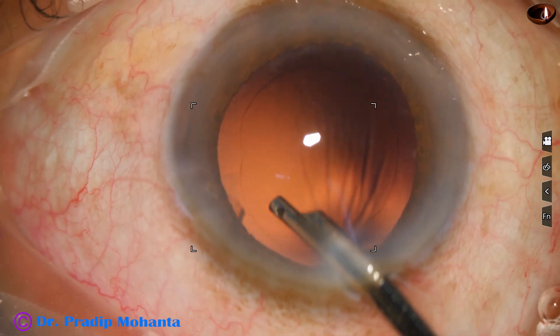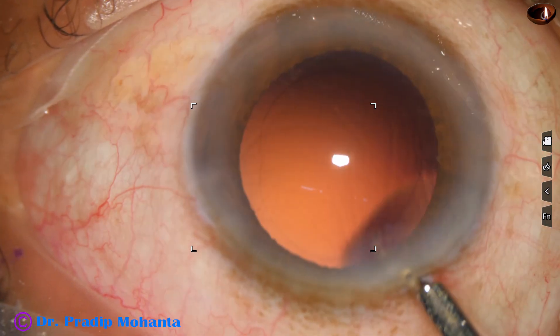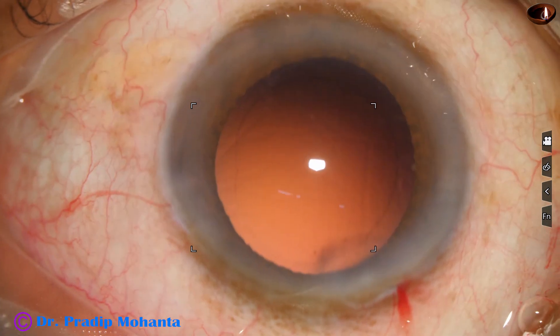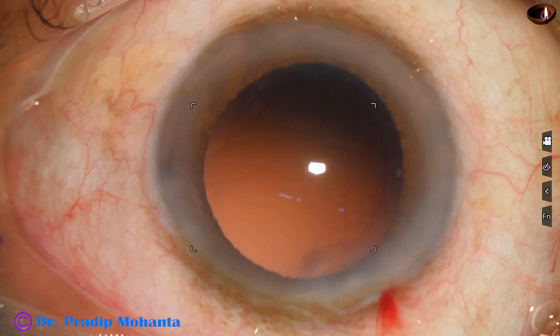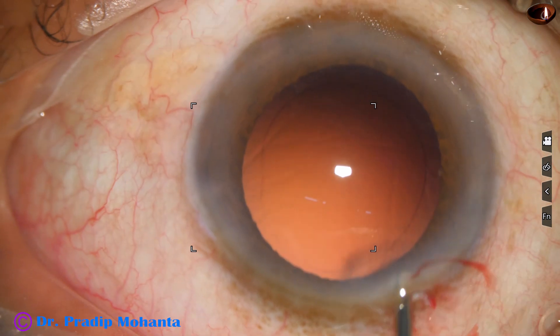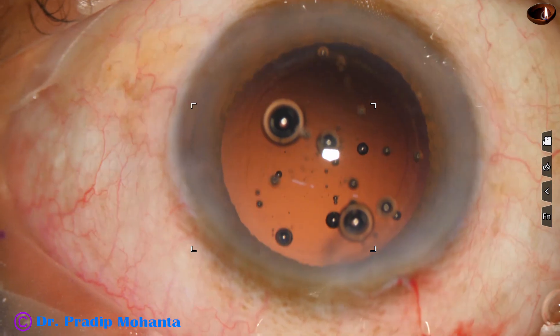We have a clean anterior chamber and a clean capsular bag. In this case, see the main incision — the left side the meniscus has gone towards the cornea. It should be a straight line at the axis.